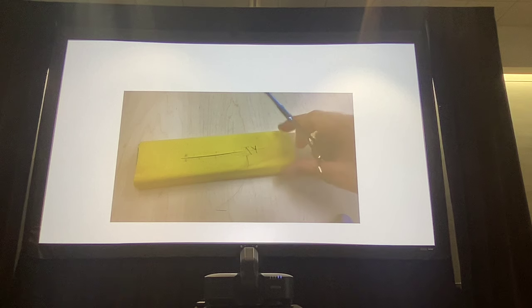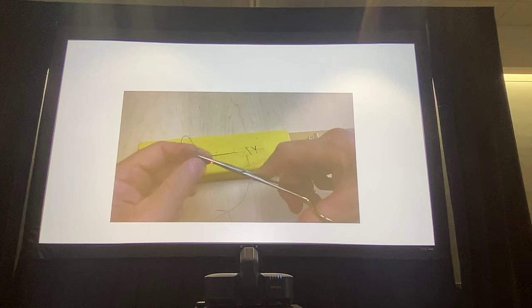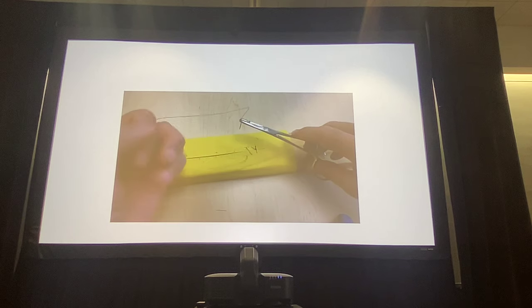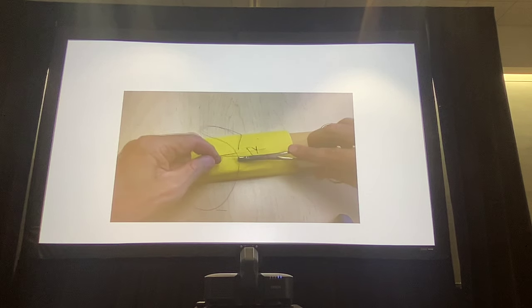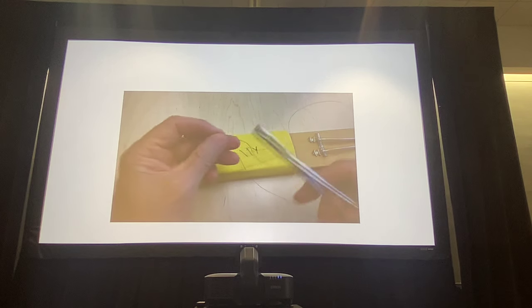There you go. Try to keep the distance in between your bites the same with every single one. Make it as symmetric as possible. And as you're moving along here, place tension on the suture so that this doesn't become loosey-goosey. If this becomes loose and you don't realize until you're down here, well, you gotta do the whole thing over again now. So maintain the tightness as you're moving forward on this closure.